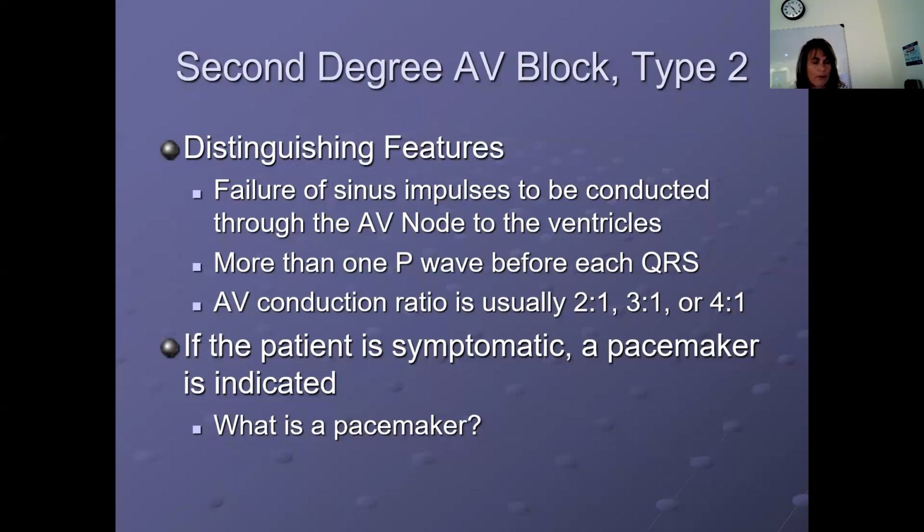All right, so now for pacemaker. A pacemaker can be external to the patient and just have wires going in through the usually subclavian vein, and it's threaded into the right atrium. So something like that would be temporary. The wires get threaded through the subclavian vein, and then the wires sit in the right atrium. And it'll send out an electrical signal, and that'll cause the heart to depolarize.